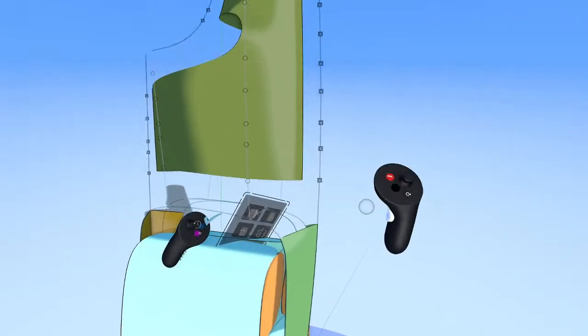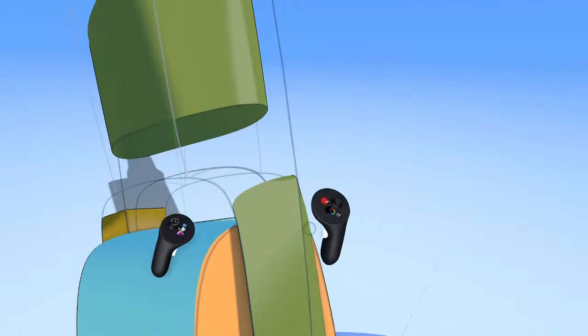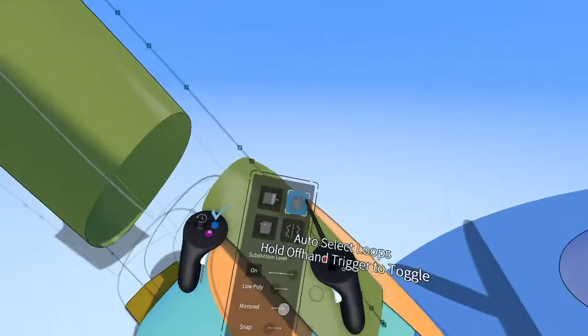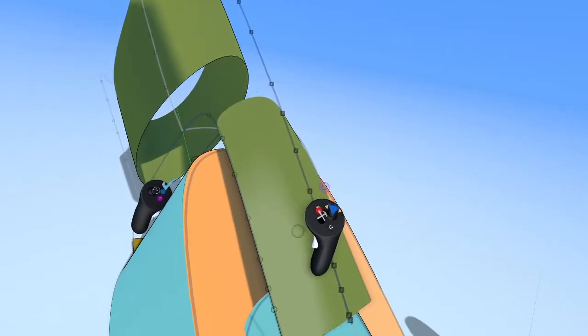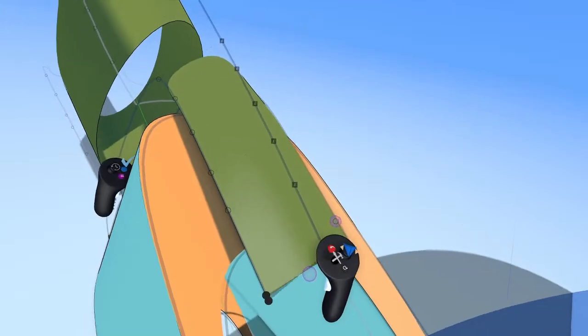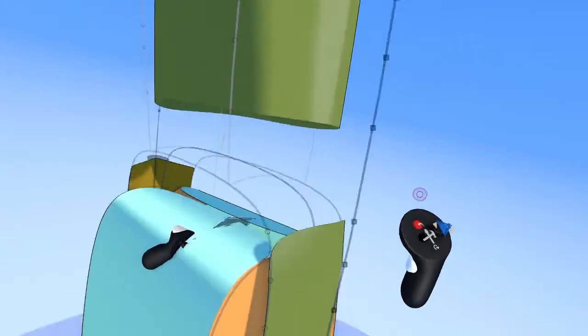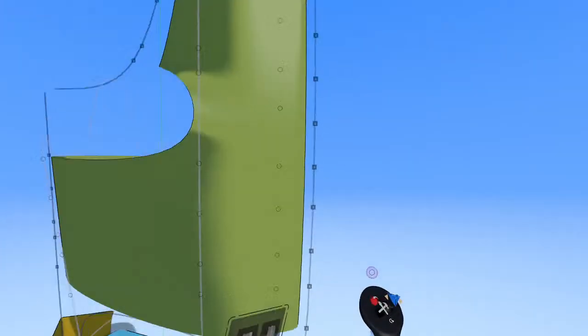All right, great. So now we have that shape. Let's come down here, connect this one over here. Again, let's connect it across the mirror plane, and let's thin out some of these edit points. We don't need all these points. If you're wondering, there is no simplify surface like there is with some other tools on Sub-D yet. I'm not sure if that's coming or not. But yeah, just so you know, there isn't.